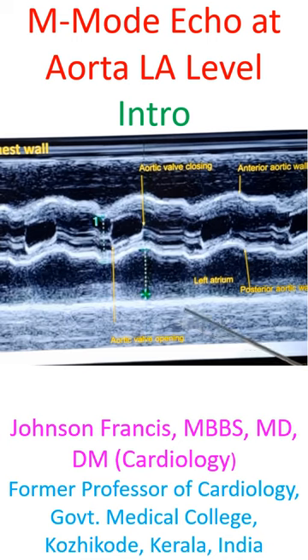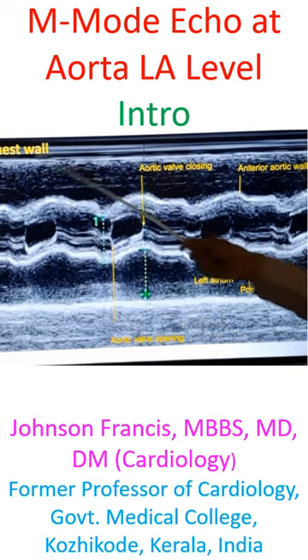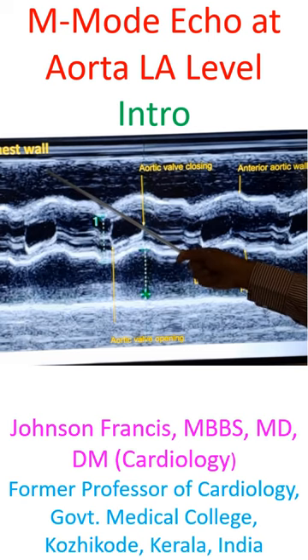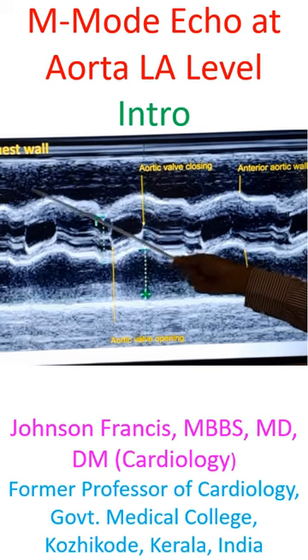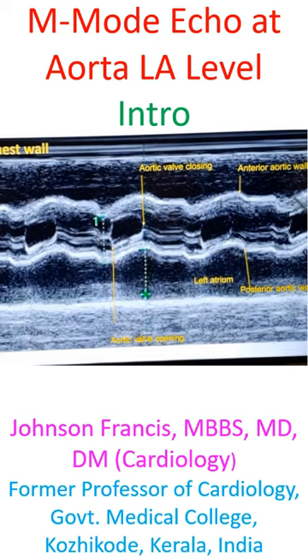This is the anterior chest wall. Just below that is the right ventricular free wall, and the RVOT region is seen here. This is the anterior wall of the aorta, and this is the posterior wall.